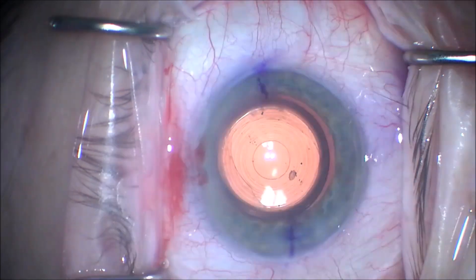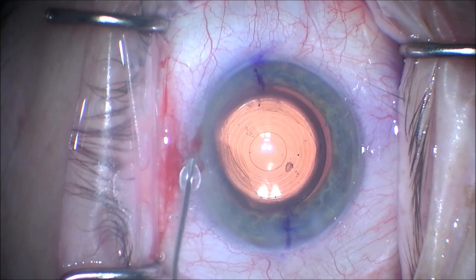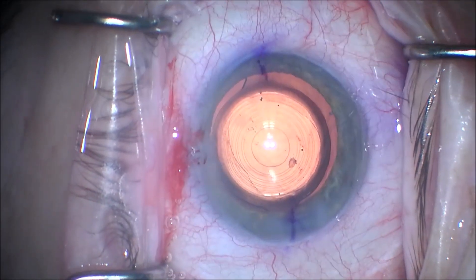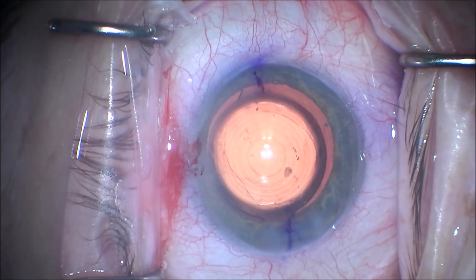The lens is well centered, and the toric marks are in good position. The viscoelastic will be removed after the position is confirmed with the ORA analysis.